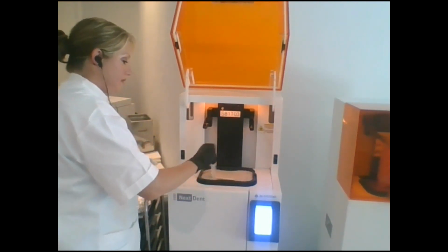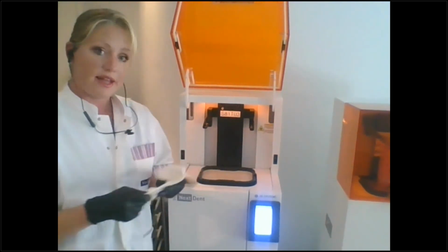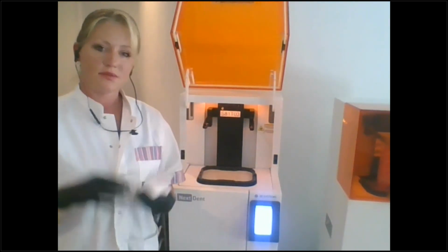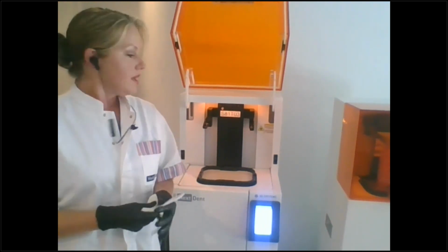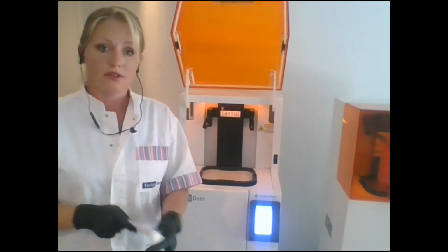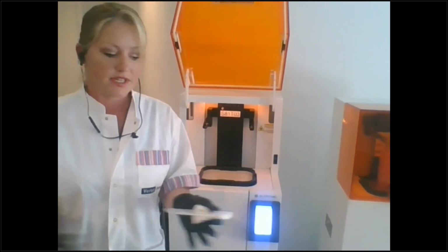Now we're doing a stack, so what we need to do is fill up this tray. Go all the way to the max line. When you do a stack, just make sure you have plenty of material in there. If you're maxing out that Z, it's around 300 grams of material that it uses, maybe a little less. But I always like to have at least 100 grams more, so I know there's plenty of flow. We don't have a pause right now, so if you open the door, you're losing whatever hasn't printed yet.